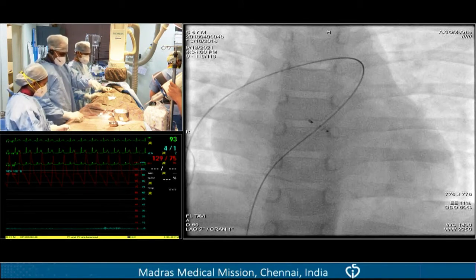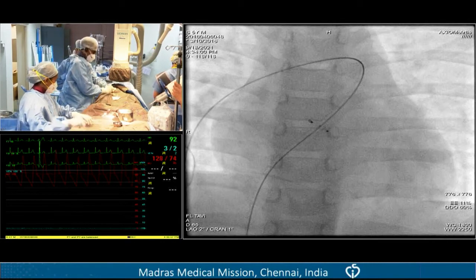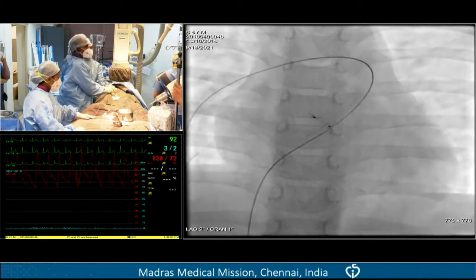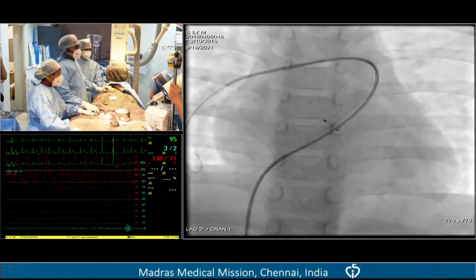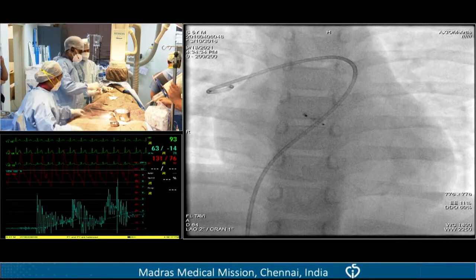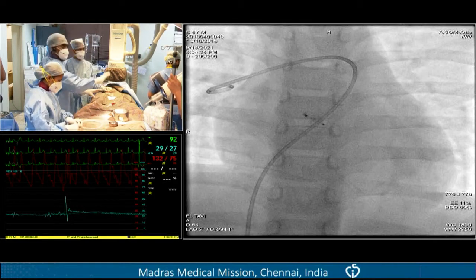Alan Press is proposing a debate at CSI between him and you, Siva, about venous antegrade versus arterial retrograde for perimembranous closure. And he's already volunteered. In fact, he's volunteered both of you, so there you go. We are now totally into transvenous alone. We don't do arterial. Most of the cases we don't take an arterial access at all, but in this particular patient we have taken one small cannula for arterial pressure monitoring, which we normally don't do. Because this is a live transmission, we just wanted a continuous monitor of the hemodynamic stability, so we have done it. Shiva, you're sorting out a debate already.